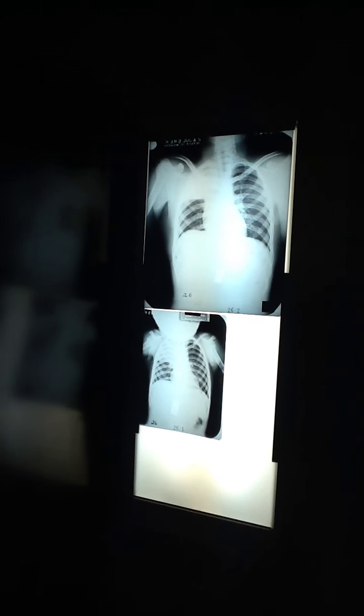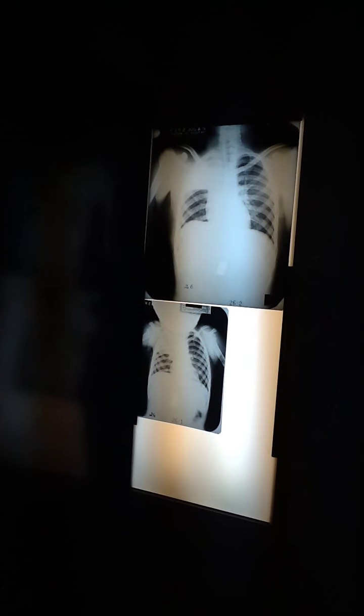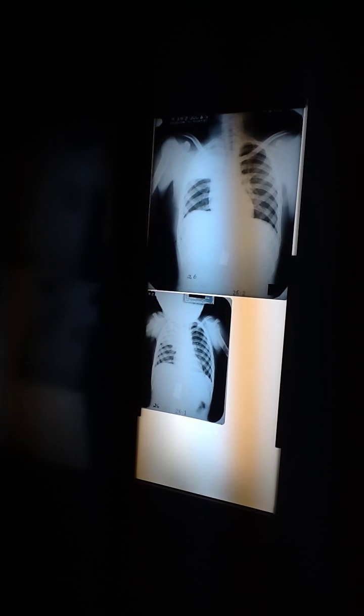So when the lung becomes pathological, the ratio changes: the ratio of how much air versus how much soft tissue. If the lung becomes opaque, as it did on those first two, one an adult, one a child, did the density change? Okay, so we know then it's an abnormal lung, isn't it? Because the density changed. Which way did the density go?